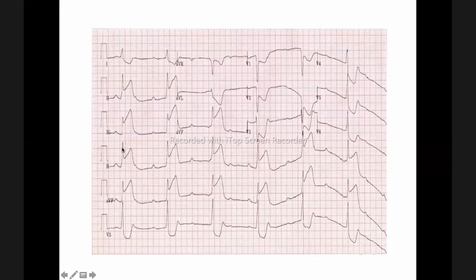What about the heart rate? What is your comment on the heart rate? There is an R, that's another R. Number of big boxes: 1, 2, 3, 4, 5, 6, 7, almost 8. 300 over 8. How much is that? The heart rate is close to the 30s, right? You can agree with me that this patient is definitely bradycardic.